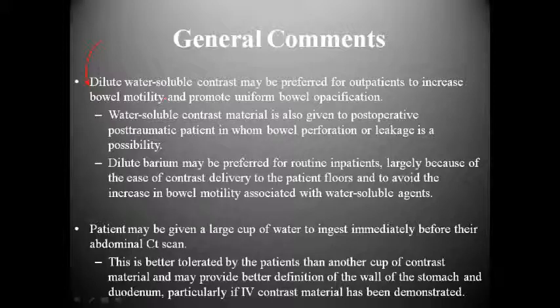On the other hand, dilute barium may be preferred for routine inpatients, largely because of the ease of contrast delivery to the patient floors and to avoid the increase in bowel motility associated with water-soluble agents. That's something that sometimes you'll hear about, sometimes you won't. In terms of water-soluble, sometimes patients say that it almost gives them diarrhea, and other patients tolerate it very well.